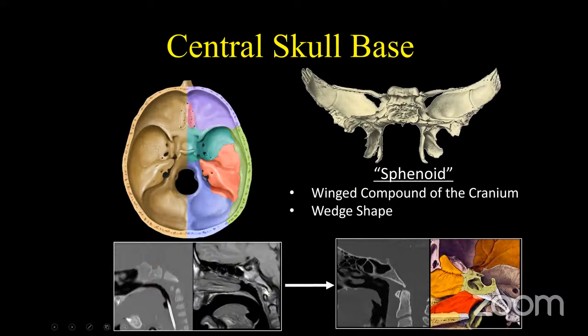So sometimes if you have pediatric children come in and they have little gaps here involving the sphenoid bone, this is just the sphenooccipital synchondrosis. And you can see it here on MR, and eventually these fuse. As a child, you can see this child is intubated, has an NG tube, I should say. Just realize that that's not a fracture, but that's just a normal sphenooccipital synchondrosis, which goes on to later fuse as you get older.